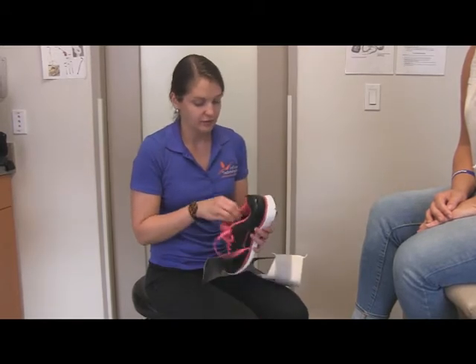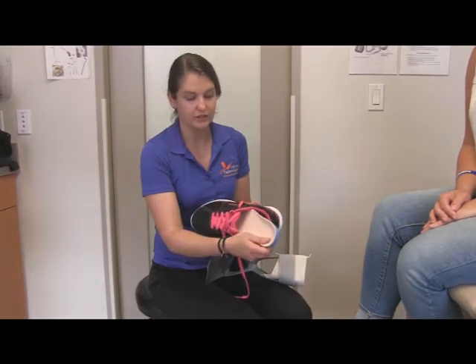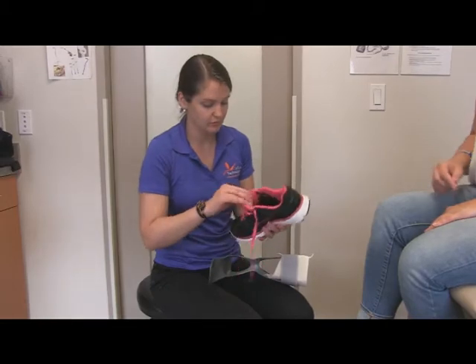In order to best fit your AFO in your shoe, if you have a removable insole that you can take out of the bottom, it will make extra room for the brace in your shoe.